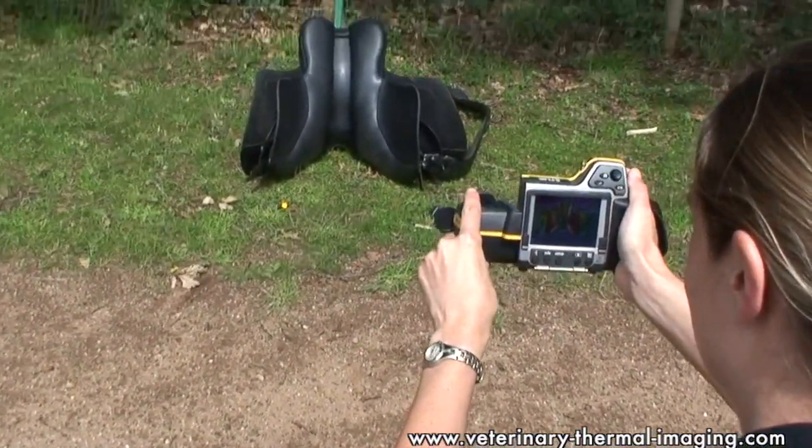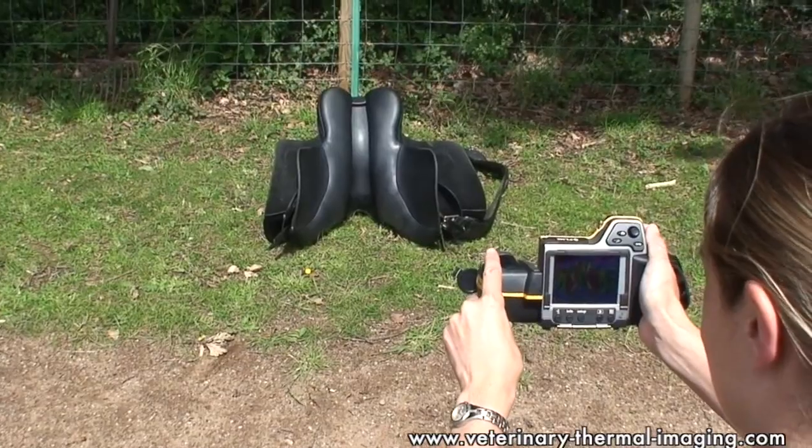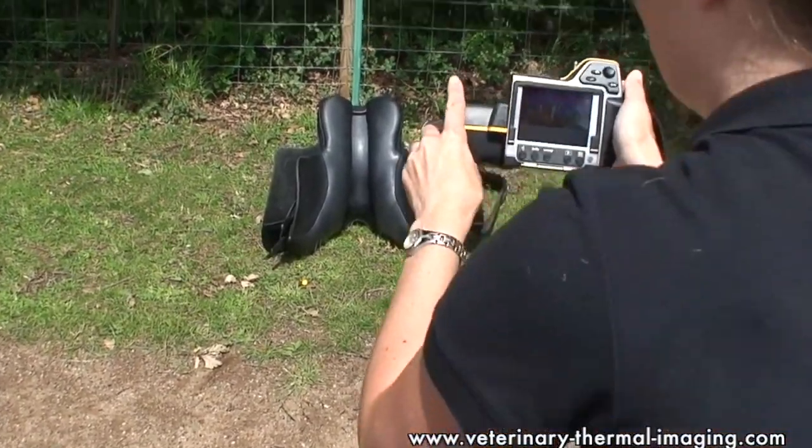For the second stage, you can either lunge or loose school the horse in the saddle, and that again will give us an idea of whether the saddle is fitting the horse while he's in work.